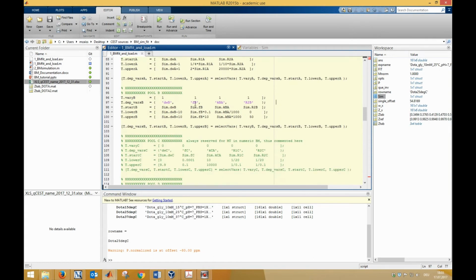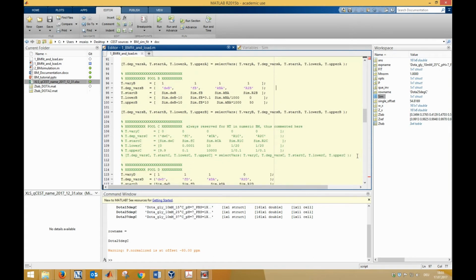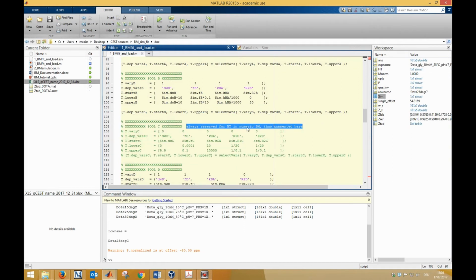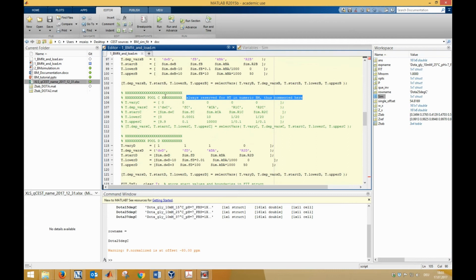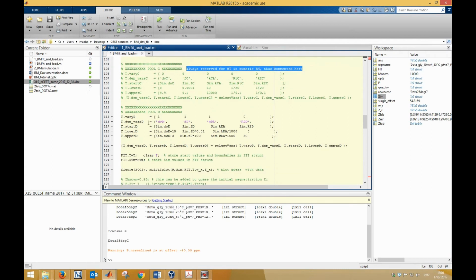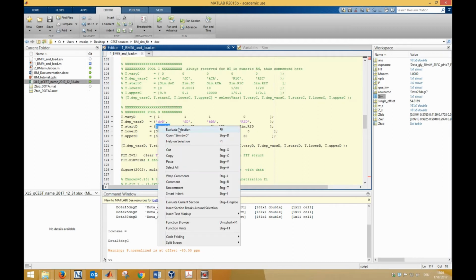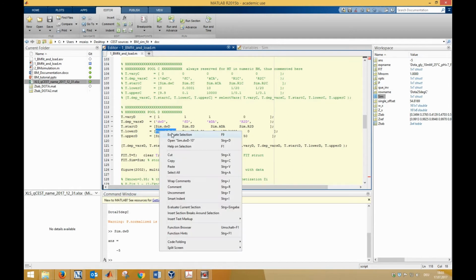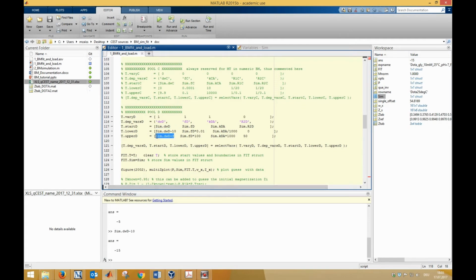And this we have to do for each pool. Pool C is commented out here, because pool C is always the semi-solid MT pool. And pool D is actually the amide pool, so again we call it from the sim. If you look at it, the starting value is around -5. The lower value will be -15 ppm and the upper value -2 ppm.